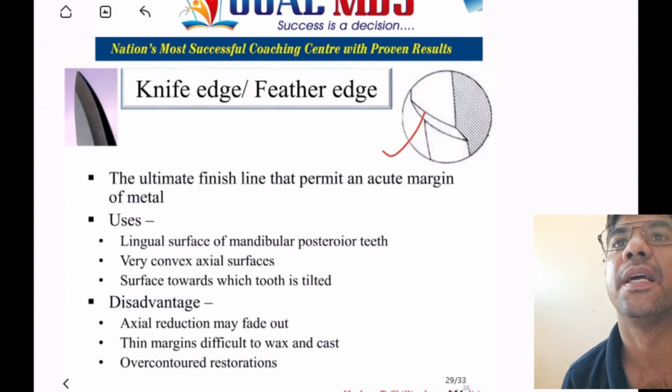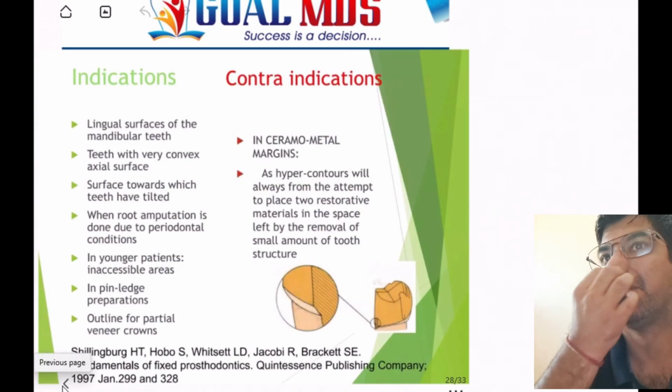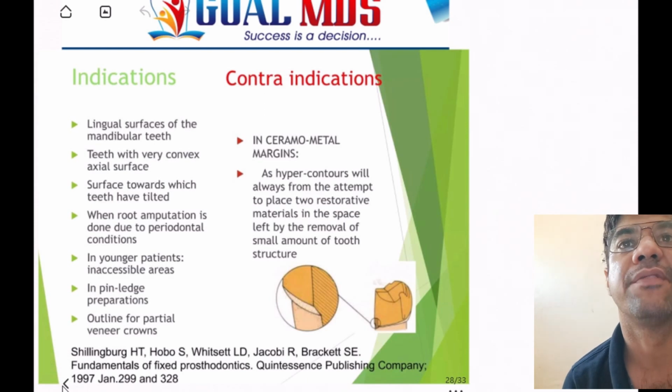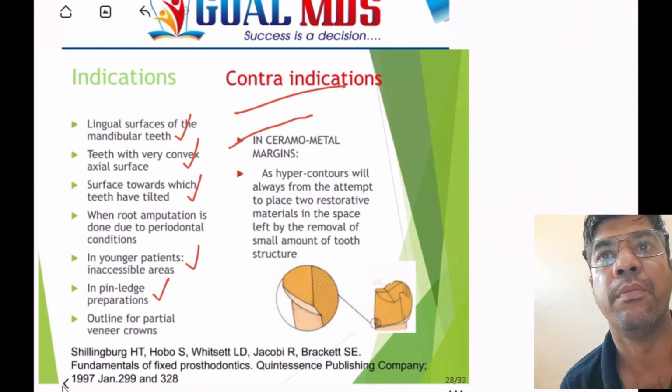Other is knife edge or feather edge margin. So this finish line permits an acute margin of the metal. It is used in the lingual surface of mandibular posterior teeth, in teeth that have very convex axial surfaces and surfaces toward which the tooth is tilted. So these are the indications. It is indicated in the lingual surface of the mandibular teeth, teeth with very convex axial surfaces, toward which teeth have tilted, in young patients, in pin ledge preparations. It is contraindicated in ceramometal margins.